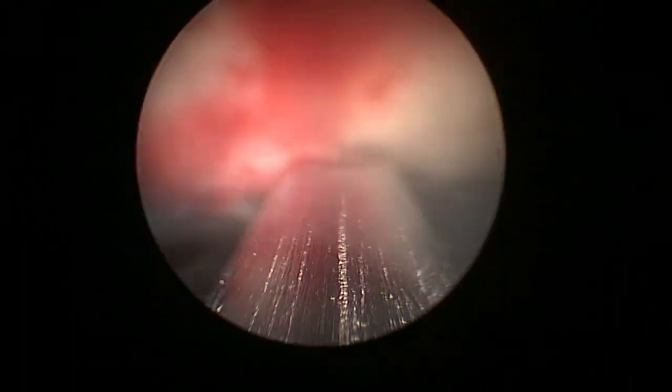Here you can see the Piranha in action. The tissue is coming out really fast, and I can do continuous morcellation. You know, one of the drawbacks of the Piranha is that the standard bottles that collect the water are a little bit small. They are 3 liters. So when you have finished the bottle, you have to stop the morcellation, change the bottle, generate vacuum again, and then start again.